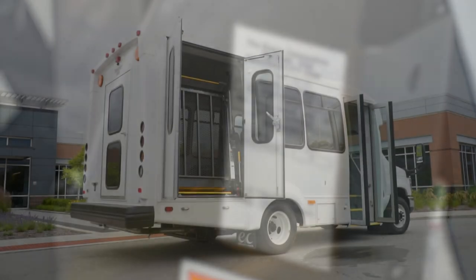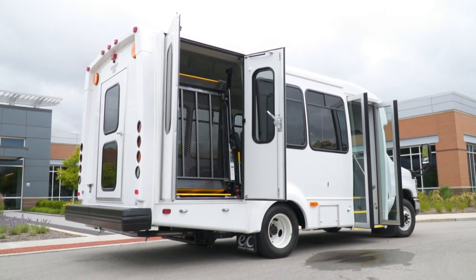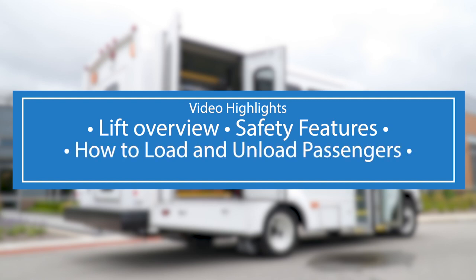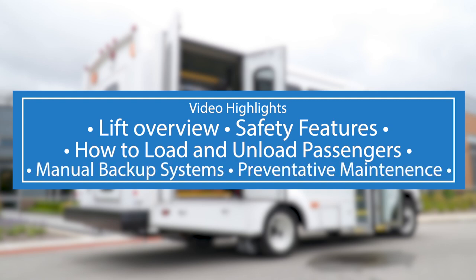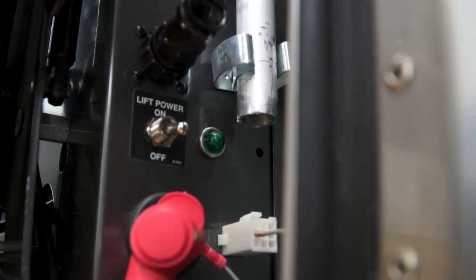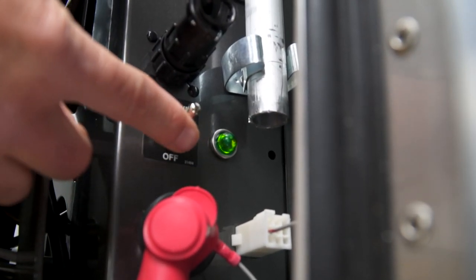Once your inspection and paperwork are complete, you are ready to learn about the proper operation of your BraunAbility lift. In this video you'll receive an overview of the BraunAbility lift, its safety features and basic precautions, how to properly load and unload passengers, operate the lift using the manual backup pump systems, and perform basic preventative maintenance. Your BraunAbility lift is ADA compliant and fully satisfies the requirements of the National Highway Traffic Safety Administration, or NHTSA.